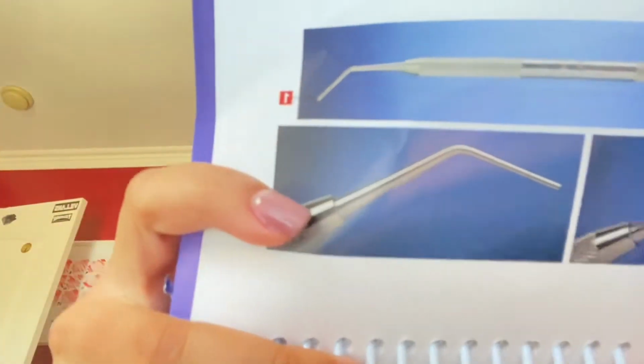So the first step, we're going to heat the Glick 1 instrument with an alcohol torch. This is going to heat the Glick, so when we go in and condense the gutta percha, it almost melts the rubber. First, this is what the alcohol torch looks like. Nothing crazy like a big regular torch, just a regular small alcohol torch.